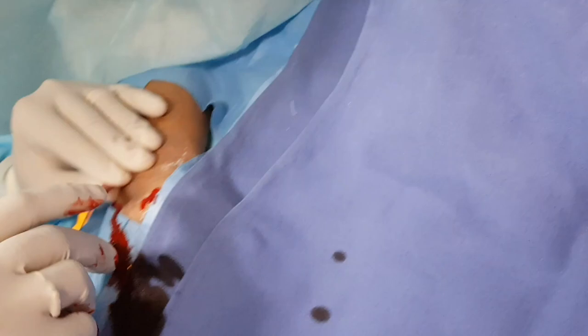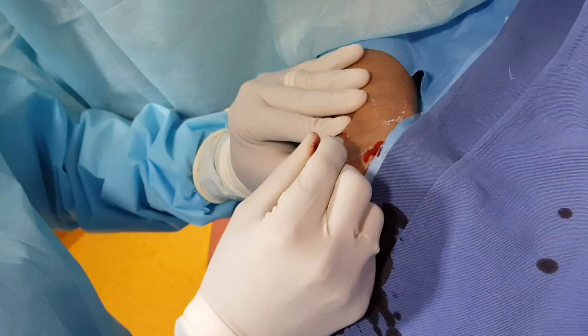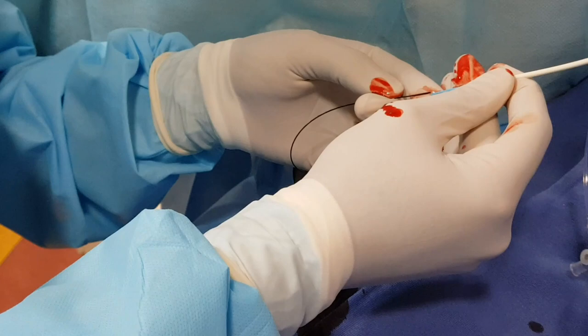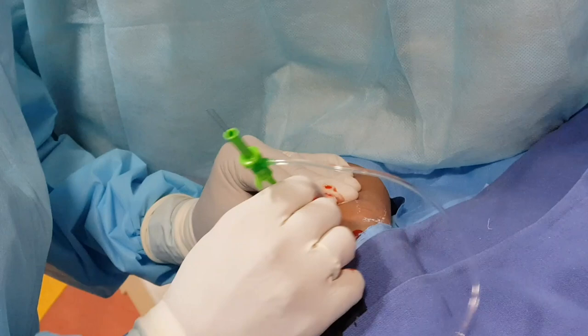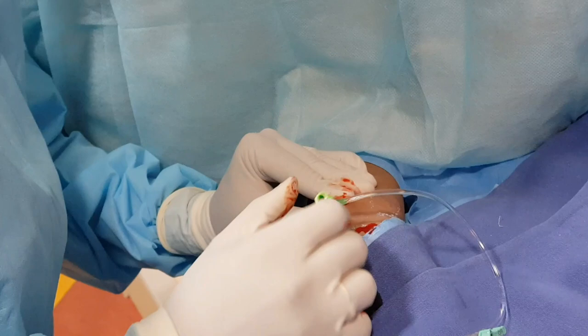Now the wire is inside the radial artery, and over this wire I will be passing a radial artery sheath. This sheath is bigger than the sheath we use for an angiogram — this is to allow the bigger guiding catheters, balloons, and wires to pass through. Now I am passing the sheath into the radial artery.